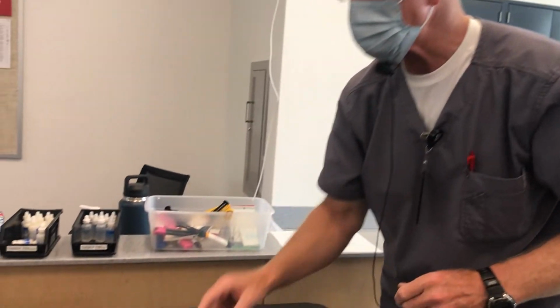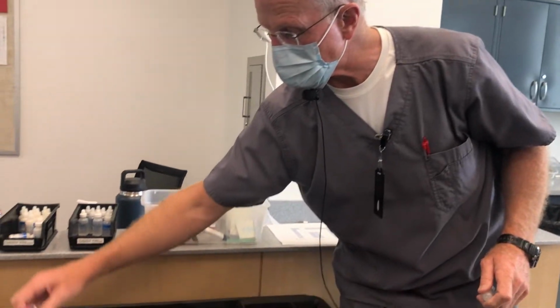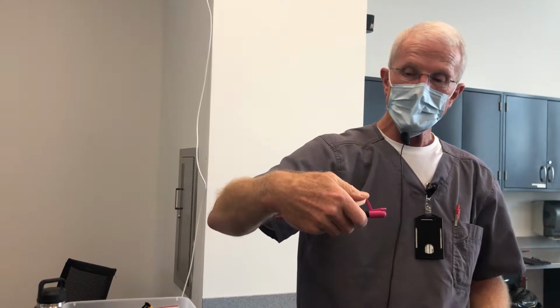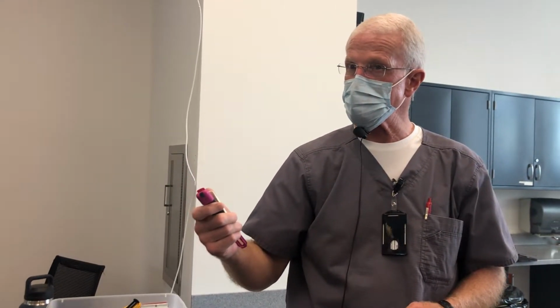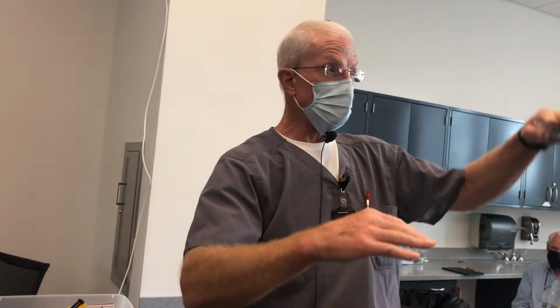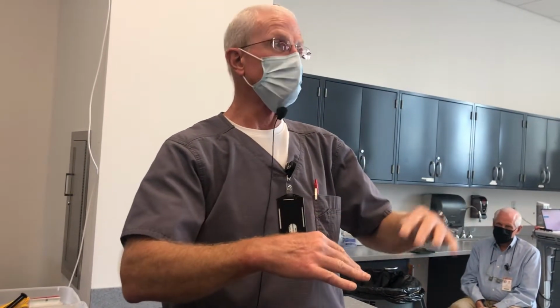Do you remember in the lecture we talked about consistency, how viscous is your cement when you're all done mixing it? With the paste formulations, like is so much the case now with these clickers and the syringe delivery auto mix, which is the case with the resin-based cements, the consistency's consistent. The viscosity is consistent because it's paste, and you're not making it more or less viscous in nature. With powder-liquid formulations, can you see how the viscosity can vary? More powder, more viscous. More water, less viscous.